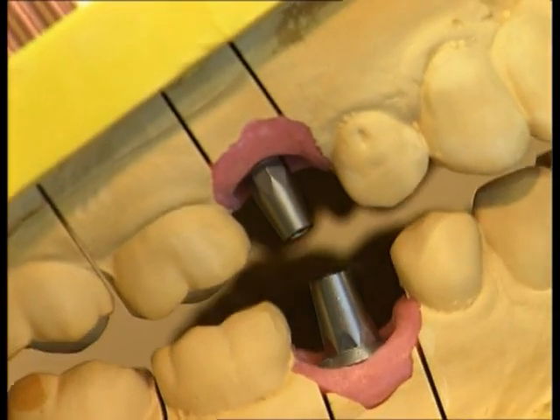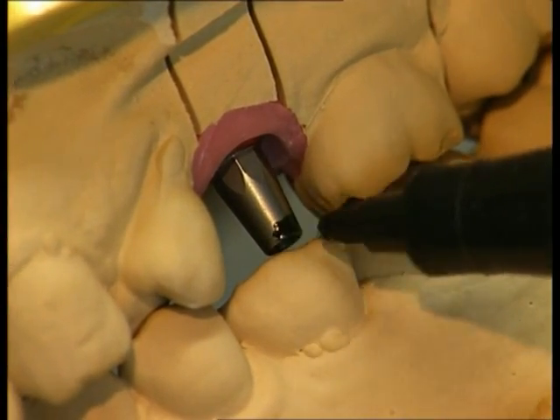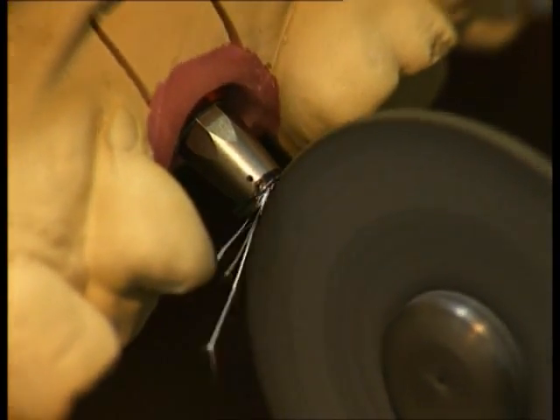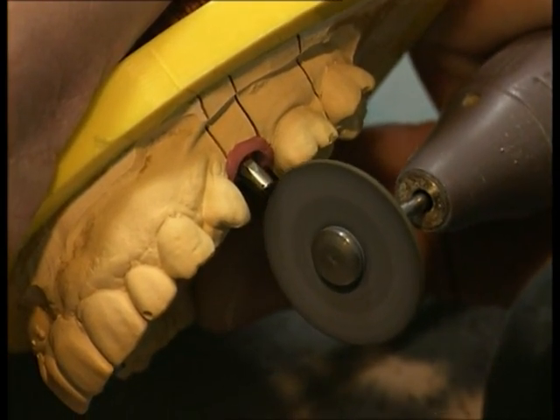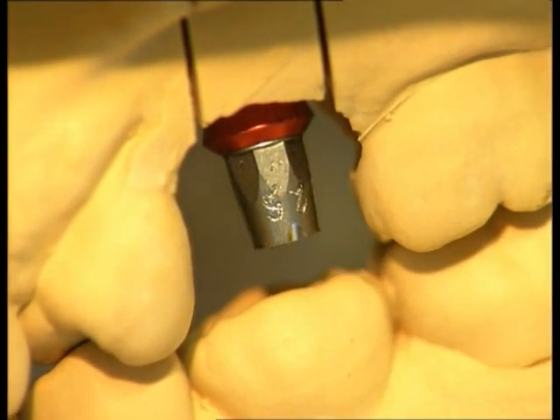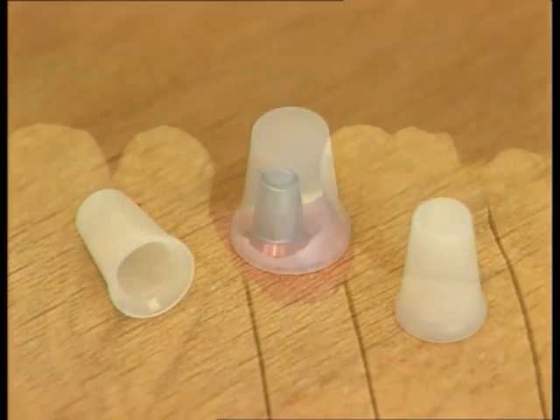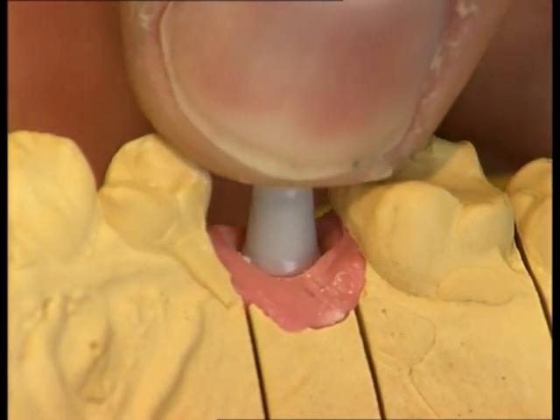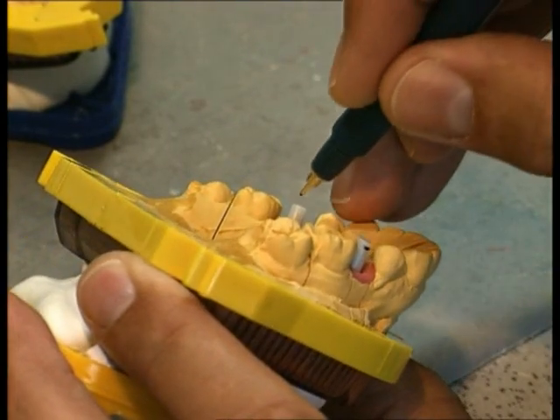Now the clinical situation is reviewed on the articulator and, if necessary, as in this case, the occlusal distance is corrected by reducing the length of the abutments. The dental technician can subsequently use prefabricated parts for creating the superstructure. In this case, castable Synocta burnout plastic copings for crowns were placed on the shortened abutments by pressing until the caps clicked into place. These caps are cut in height as required.